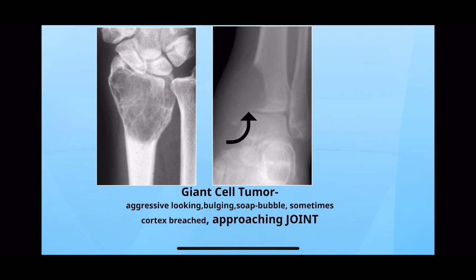Giant cell tumor is a locally aggressive benign tumor — it will give you the look of a malignant lesion, but it is not malignant. There will be a large soap-bubble lytic lesion approaching the joint. You can see here the joint is almost invaded — in radius and in tibia also.